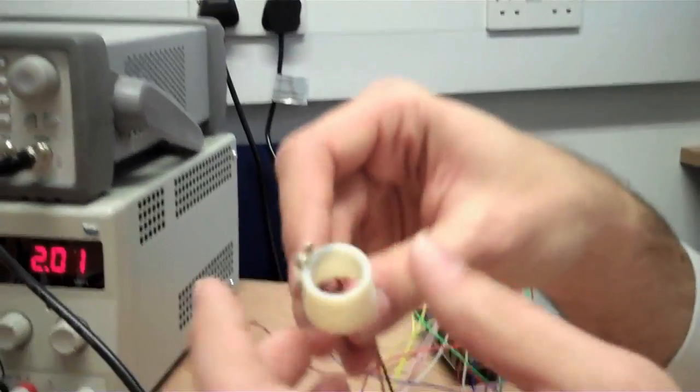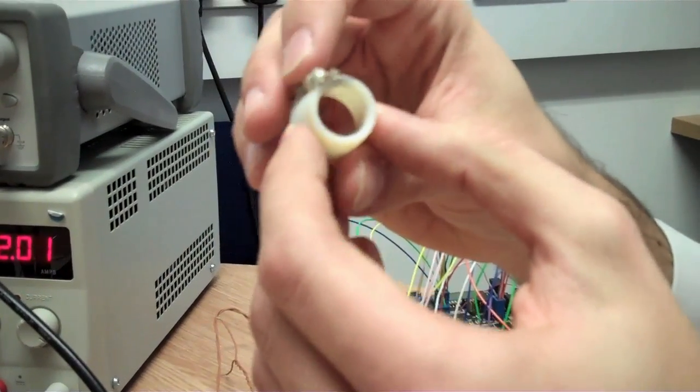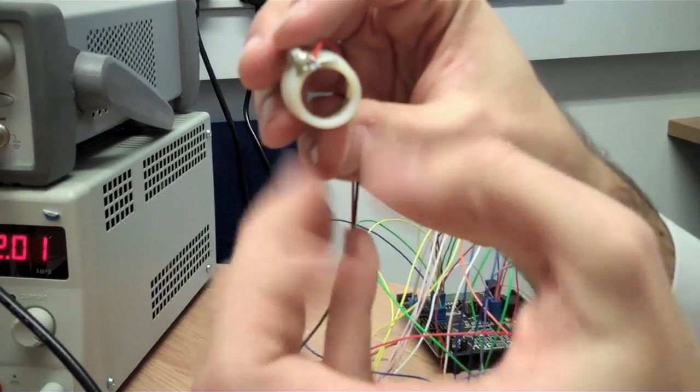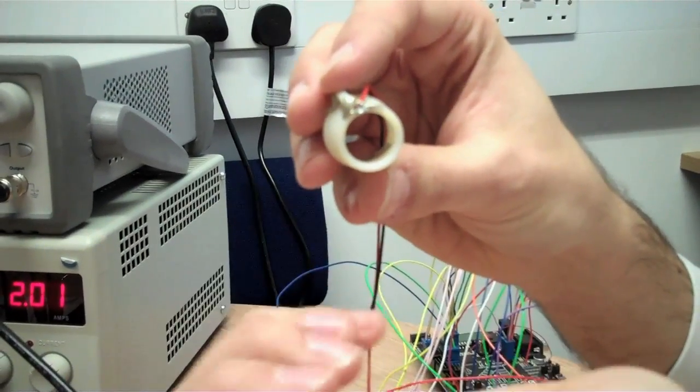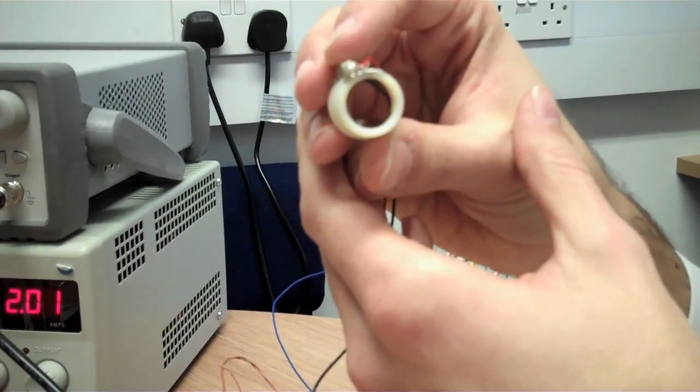The final device was based on a material called a shape memory alloy. This is a wire that you can see through the bottom here. When we heat this wire up, it gets shorter and applies a pressure to the fingertip in a similar way to the previous device.